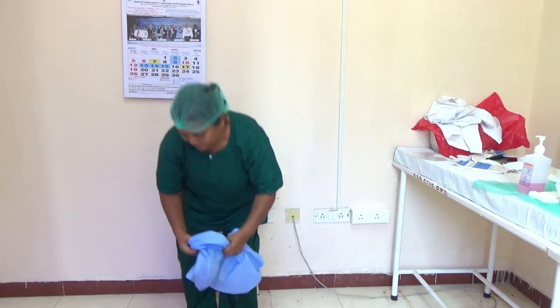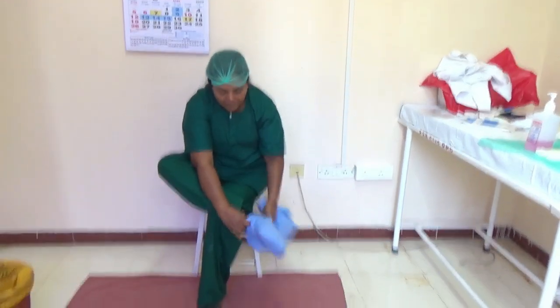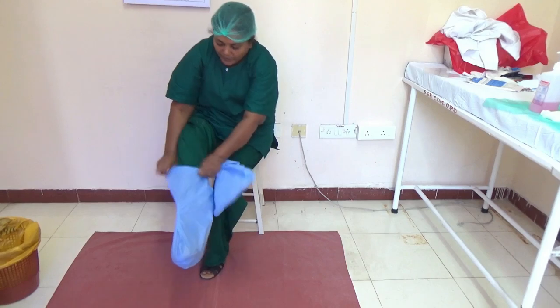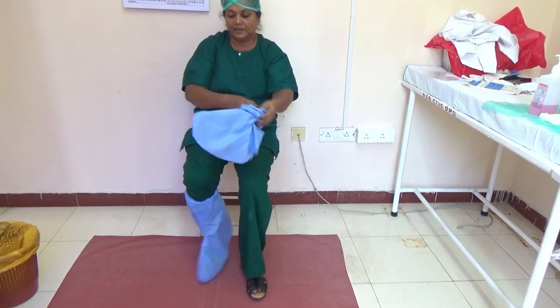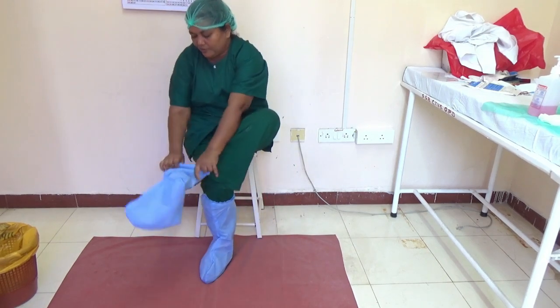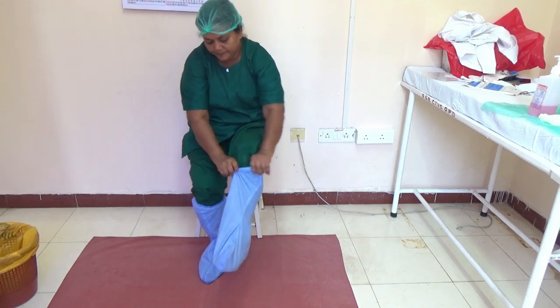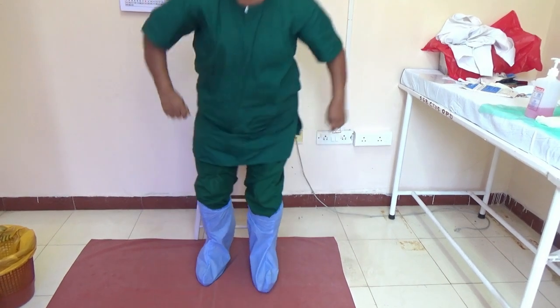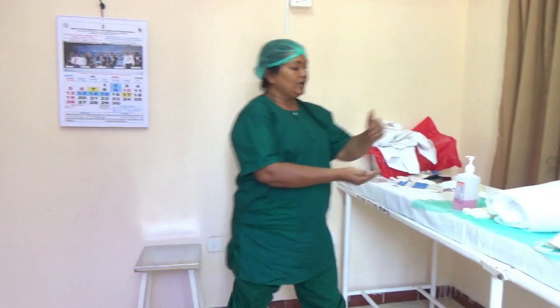When you wear the shoe cover, you can sit comfortably. It has to come till the knee. The same way the other shoe cover — you can pull it till the knee. After wearing the shoe cover, we may have touched our shoe, so you have to do hand hygiene.